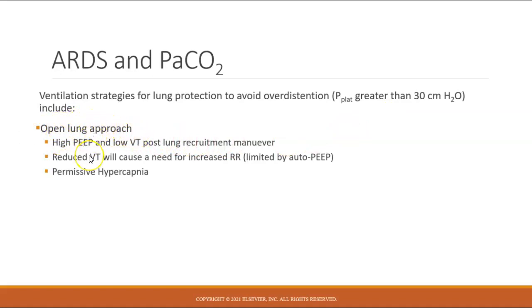You might have learned about this or looked at this a little bit more when you did your ARDS patient in Jim's class. That open lung approach is using those high PEEP levels to open the alveoli up, and low tidal volumes to ventilate. Usually this can be done after a recruitment maneuver, because then we've opened everything up. Now we're just trying to keep it open.